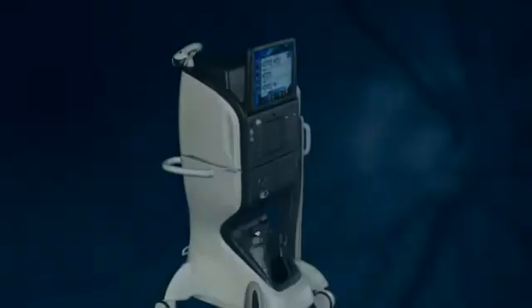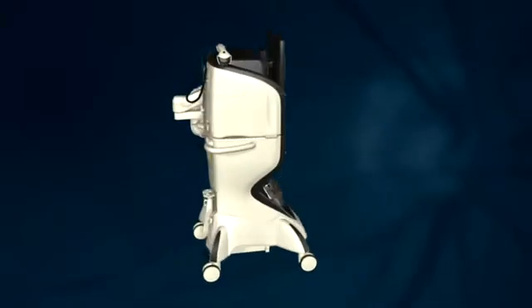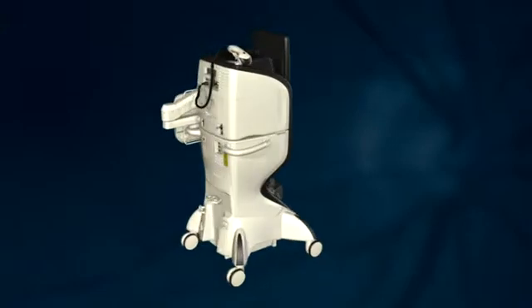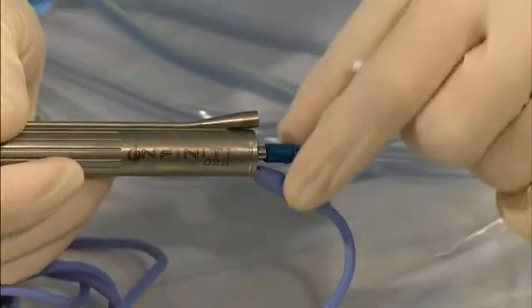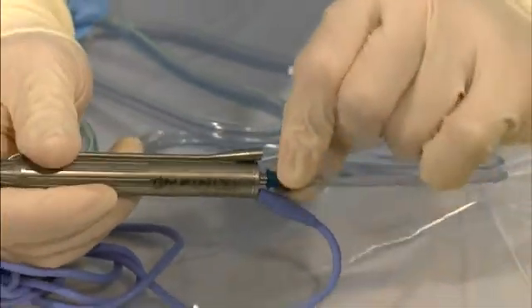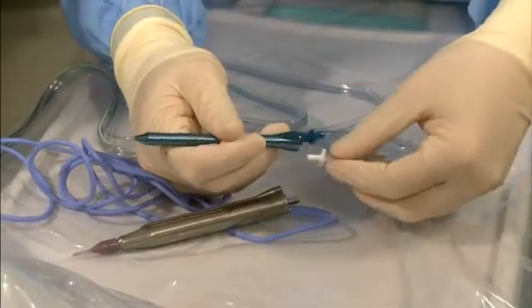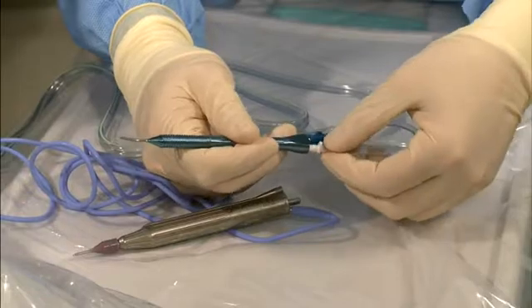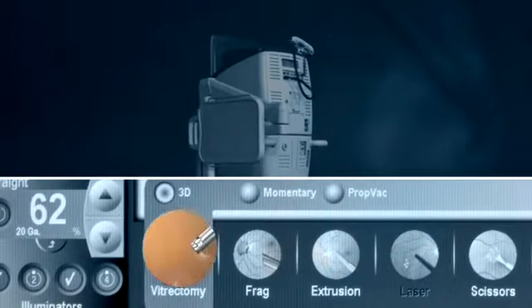In addition, the Constellation Vision System anterior segment functions include emulsification and removal of the lens, including the OZL handpiece technology, irrigation and aspiration, and anterior vitrectomy.